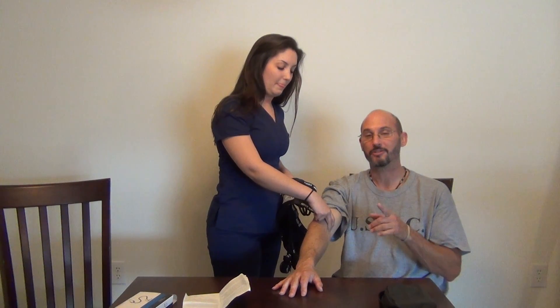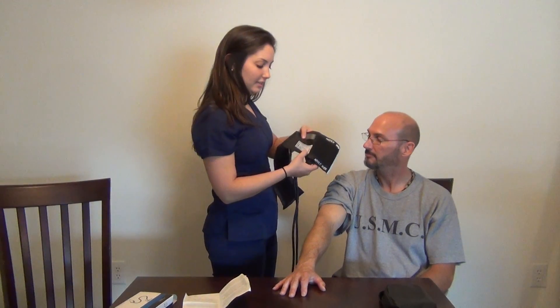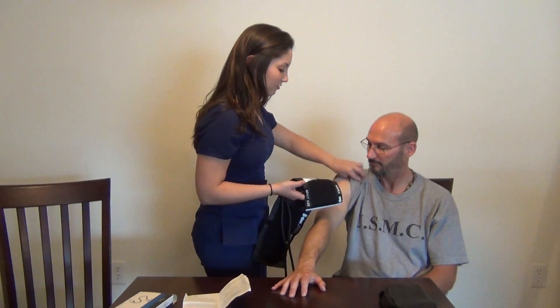This is an interesting point I learned a while ago. My dad was a CPR and first aid instructor, and he taught us that the reason you use these two fingers is that the thumb has a pulse of its own. So you don't want to check blood pressure or pulse with your thumb — that's why you use the two fingers. So once you find the artery, you can go ahead and align that right arm arrow up with the artery.